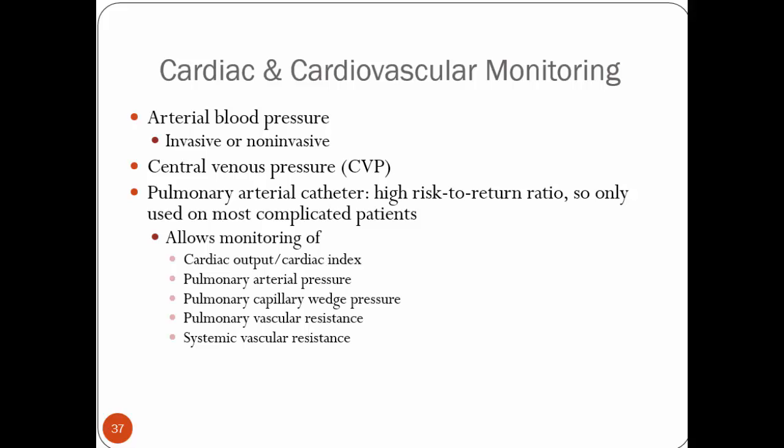And so this is a non-invasive type. And most times in ICU, these are hooked up to the cardiopulmonary monitor that's above the patient on the wall. And they'll program them to run every so often. So you can program them to run every 30 minutes. So anytime you're concerned about the blood pressure, you probably need to reach up and cycle that blood pressure cuff on so that it gives you a recent reading.